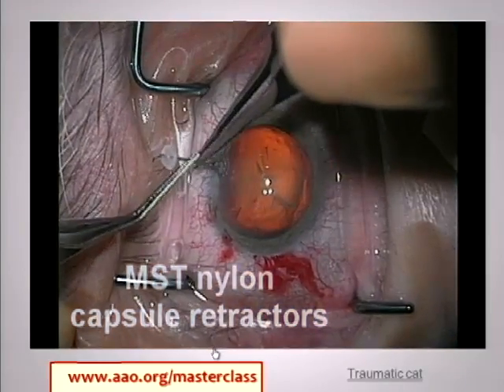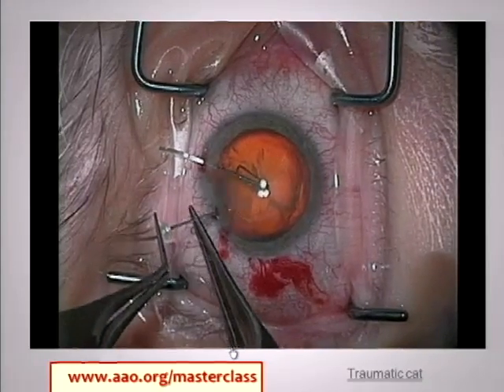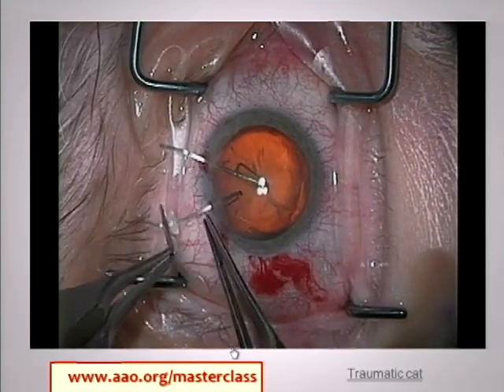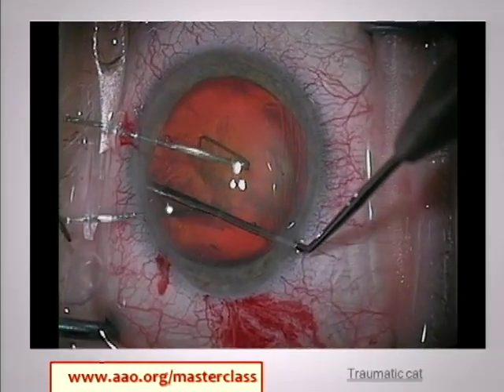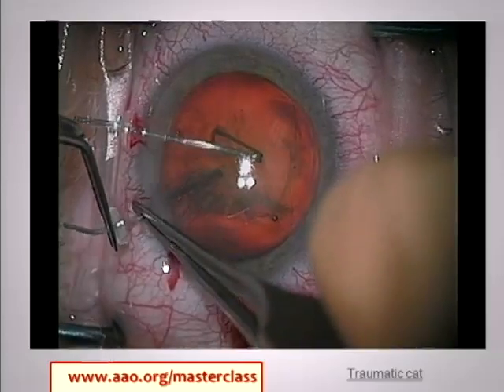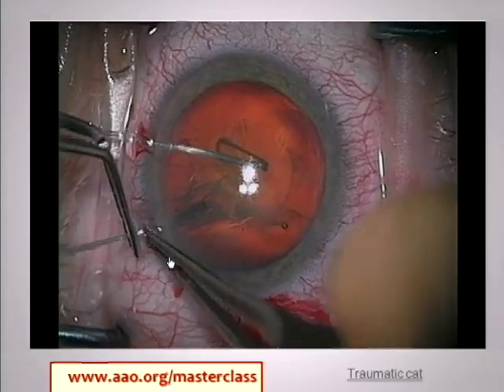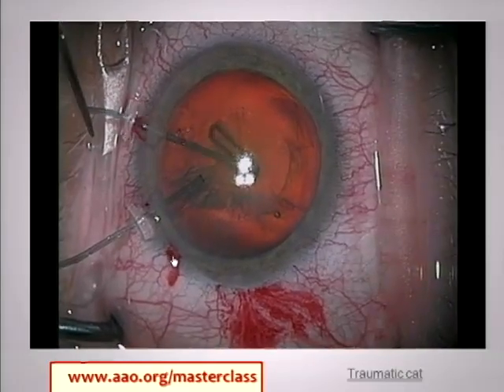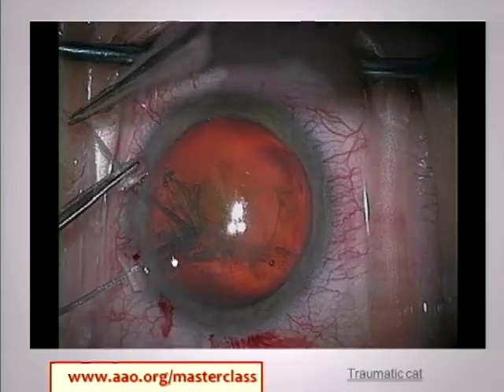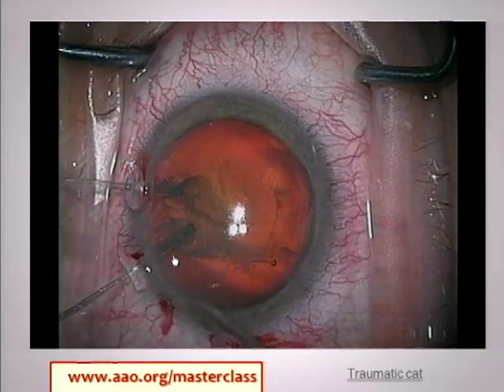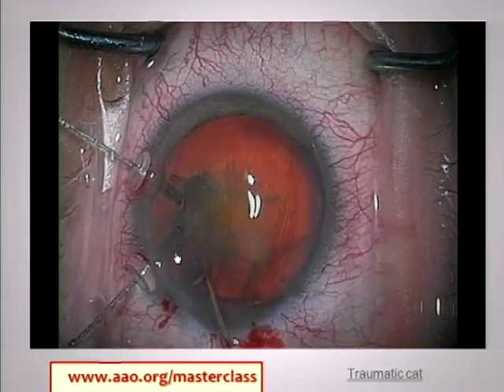These are the MST nylon capsule retractors. They come three to a set because usually you don't need more than three, and often you'll need one or two. They go in through clear corneal stab incisions, and they're double-barreled 5-0 nylons so that you end up with this loop on the end, which I think is more capsule- or bag-friendly and less likely to perforate through.